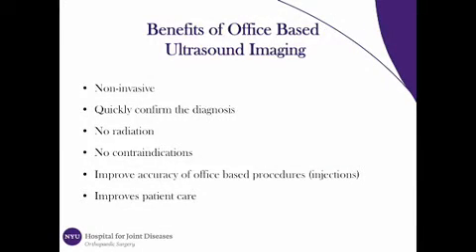There are multiple benefits of office-based ultrasound imaging. It's non-invasive and can help you quickly confirm your office diagnosis. It emits no radiation and has no contraindications. It also can help improve the accuracy of office-based procedures such as injections. Finally, it improves patient care and helps foster the doctor-patient relationship.